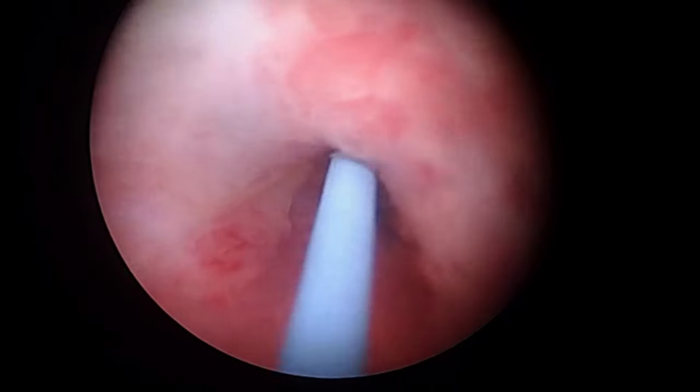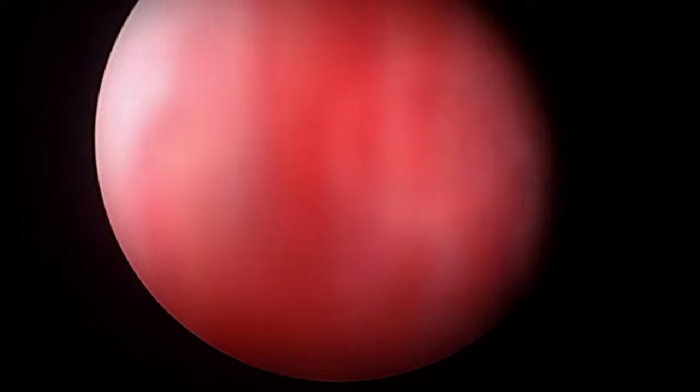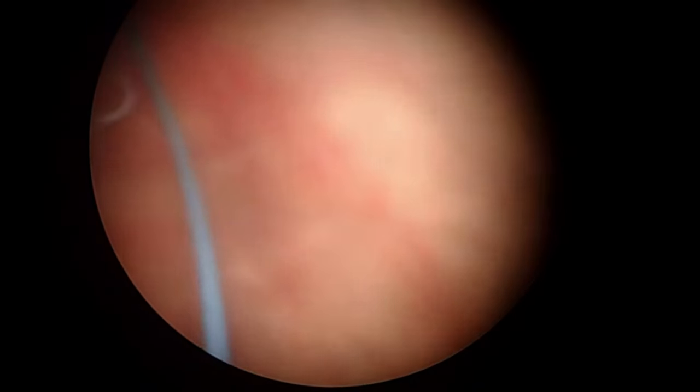The area is now dilated. We don't see the stricture anymore. We're making sure that the wire is inside the bladder and then we can maneuver our scope into the bladder with minimal trauma to the surrounding area.